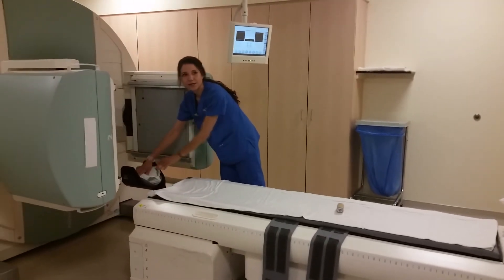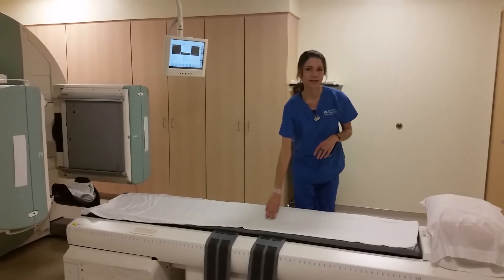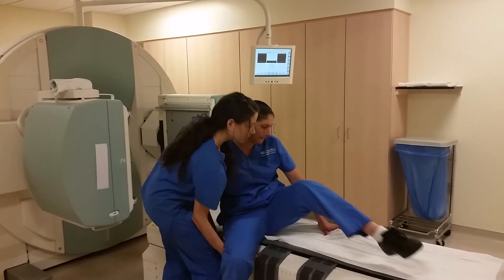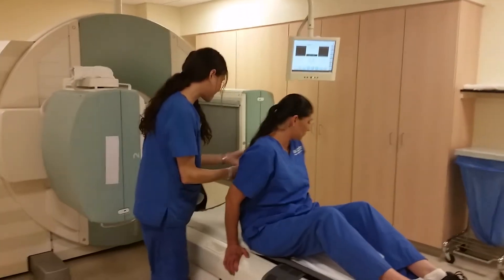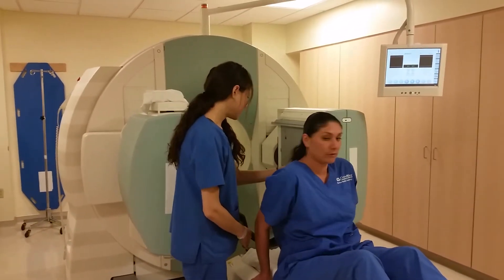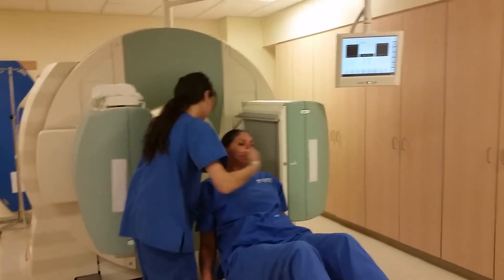I have these two cushions right here just to help keep her head straight and sturdy. Okay Jessica, so I'm going to need your legs to come up this way. Can I help you up? There you go. And then can you take just a couple of scoots back for me? I'm going to want your head in this headrest right behind you like that. I think that's going to be good. And then I'm going to want you to lay back. There you go.